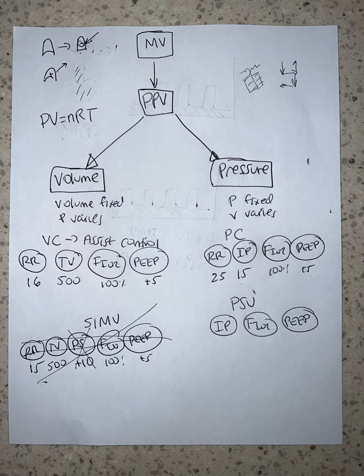Okay? So again, if the patient is breathing 35, they'll get 35 breaths with a burst of 15 of pressure support, of inspiratory pressure. Okay? The other way to do pressure ventilation is called pressure support.